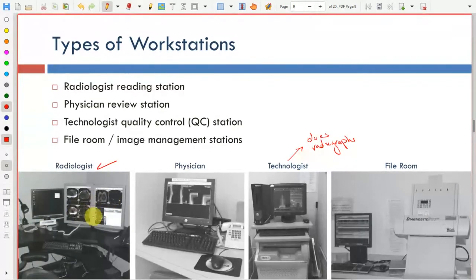For these images, if you have the slightest change between the different color or RGB, because you have grayscale here, the images might look a little bit different, which can be really difficult for the doctors to observe. And you have to actually do the calibration, and you have to make sure that the way the images are displayed is also calibrated. So if you have a gray level of 100 and a gray level of 200, you have to see the difference between these two exactly the same for all monitors.